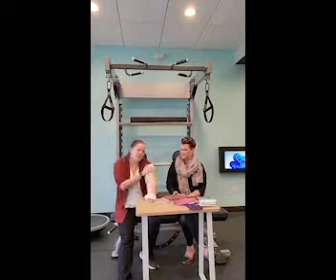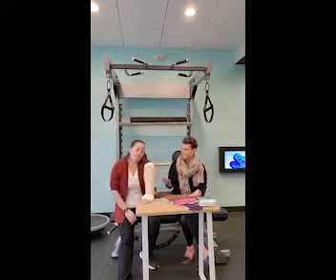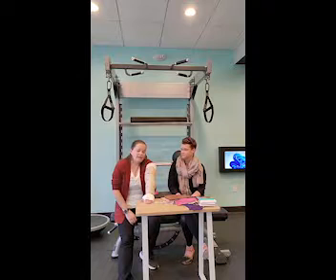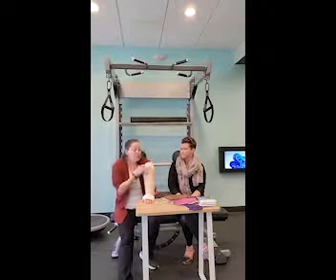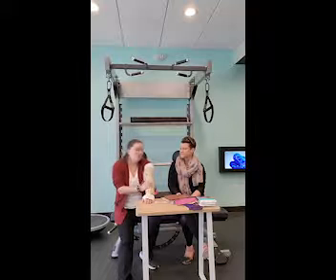So this is a very nice option. It's an alternative to your bandaging. Bandaging is the gold standard, but compression wraps can be an alternative. I have done that where someone lives alone, with no real support directly around them, and they just can't bandage themselves, so we'll go with a wrap like this. Again, it's a little bit slower. It's not the best method, but it's the best method for that person. They just could not manage themselves, and so that is an option with this as well.